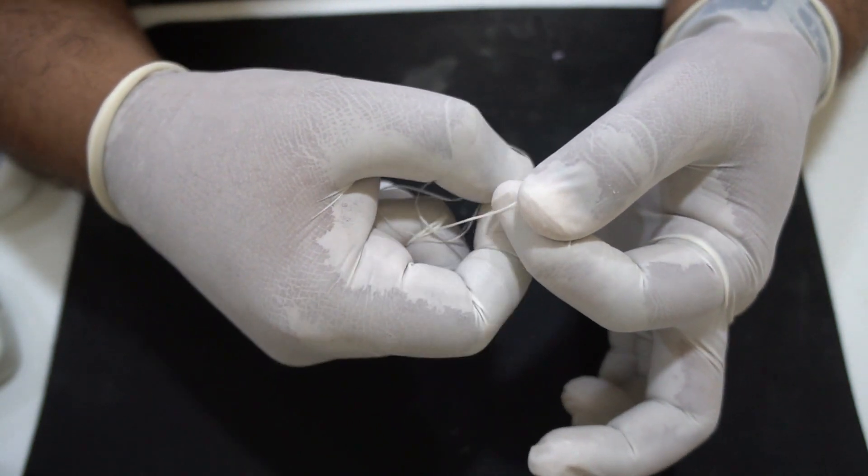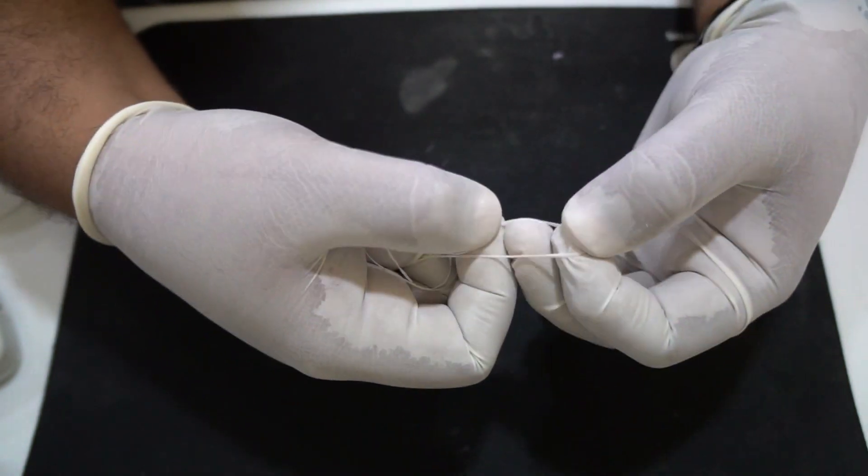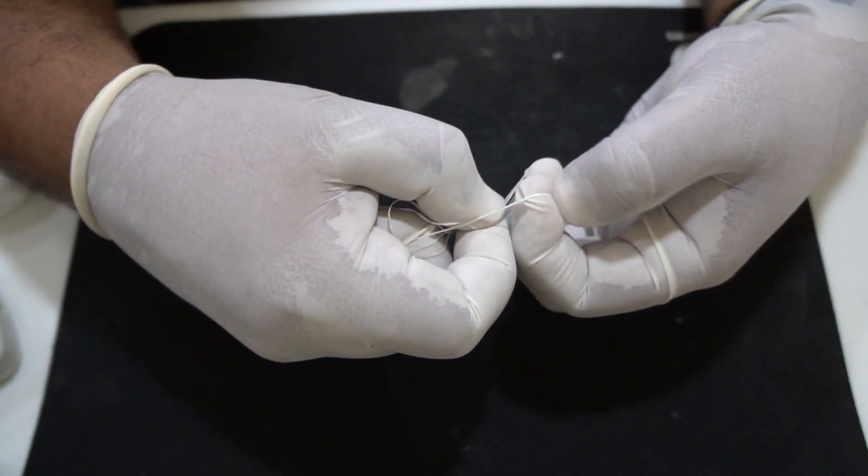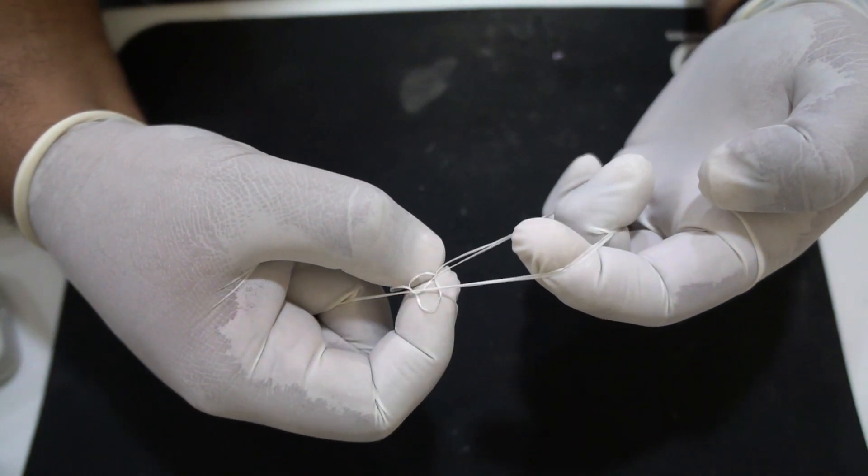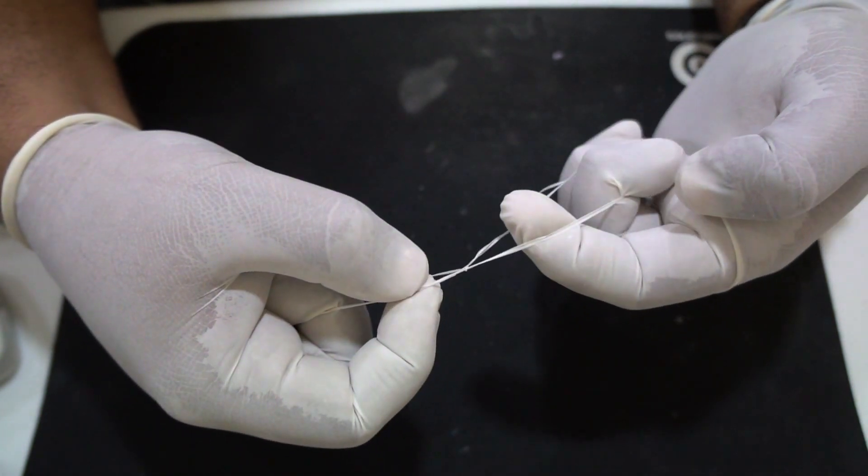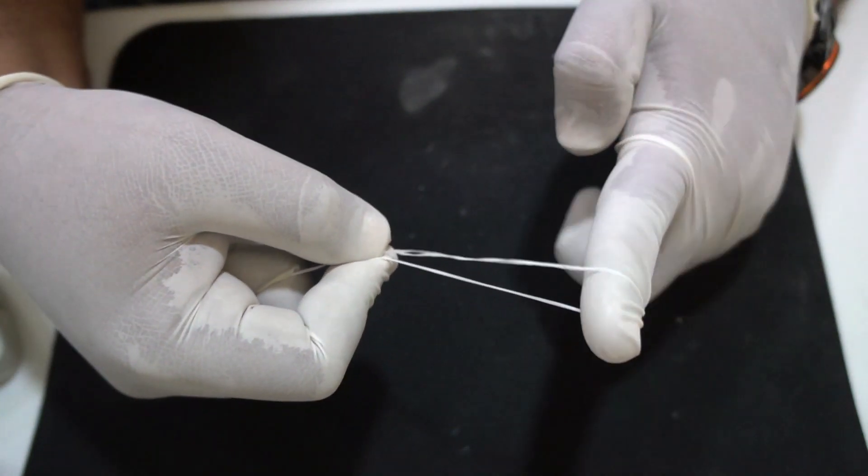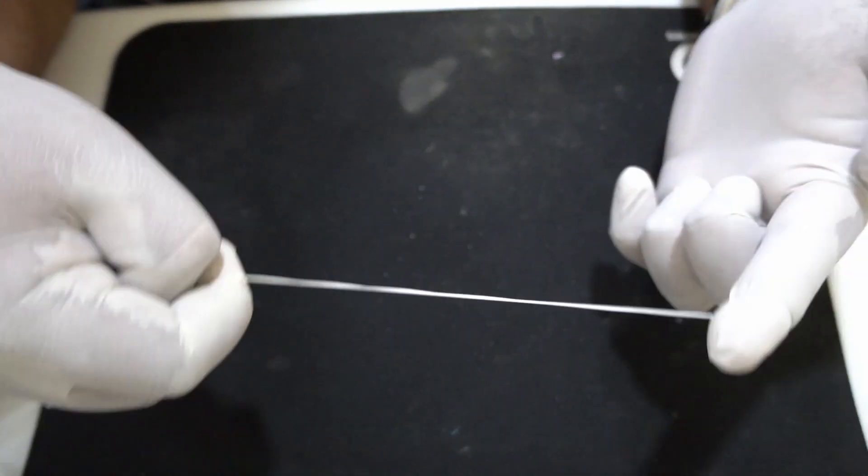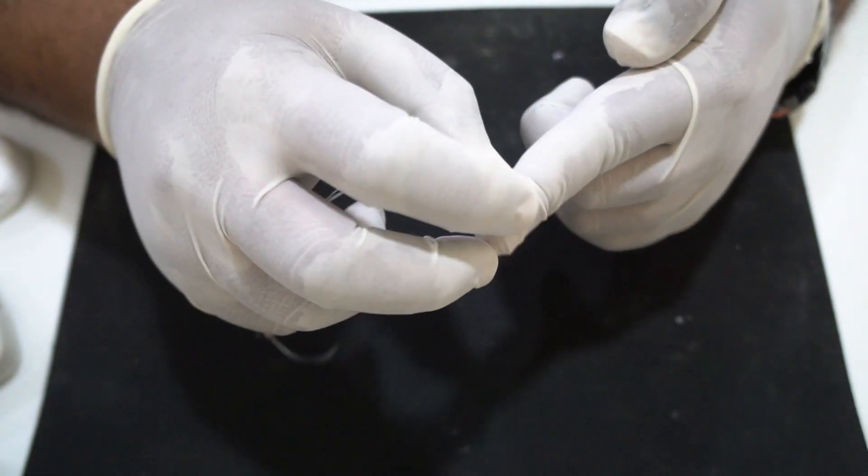Make sure you are holding this floss tight. Now slowly move this part of the floss towards the end. And now you see this, you have a floss ligature. All you have to do now is hold this and stretch and you have a tight floss ligature.